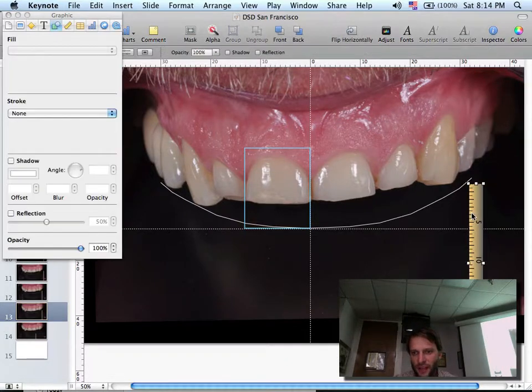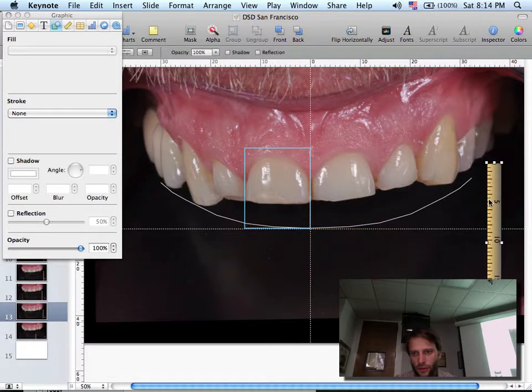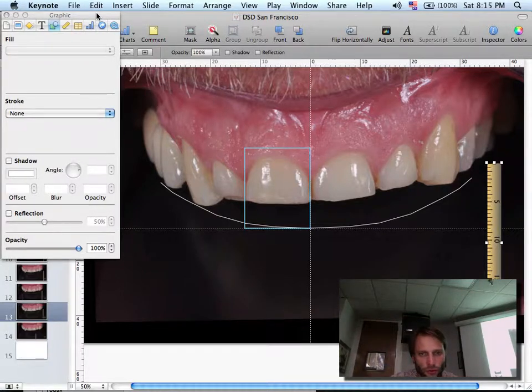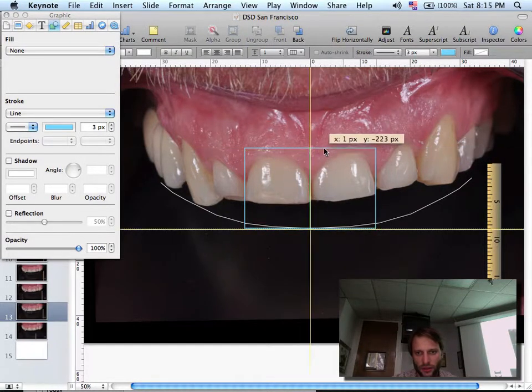So I'm going to pretend that that was my final decision. There's 1 millimeter over here, and I'm pretty sure that he can handle this plasty without harming the biological width. Okay? So this is nice to be able to have this information when you're planning the case. So I'm going to start from this point, my drawing. So I'm going to duplicate this and position it on the other side.